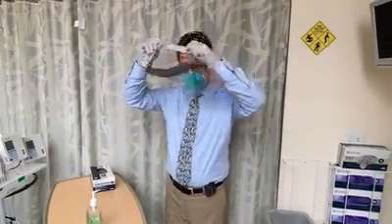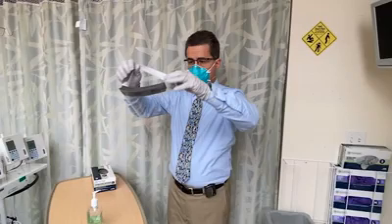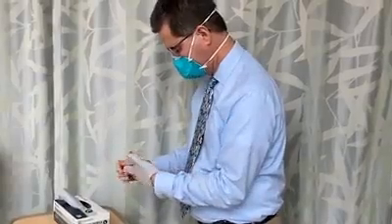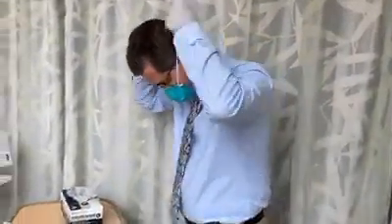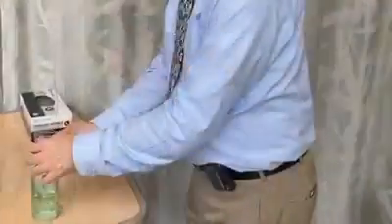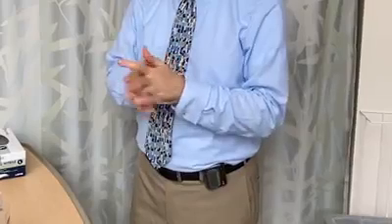Put on a new pair of gloves and then remove your face shield and dispose of it, or clean and store it in accordance with the guidelines at your institution. Rewash your hands and put on another pair of gloves. Then remove your mask and follow your institutional guidelines for disposal or reuse. Finally, remove the last pair of gloves and wash your hands.